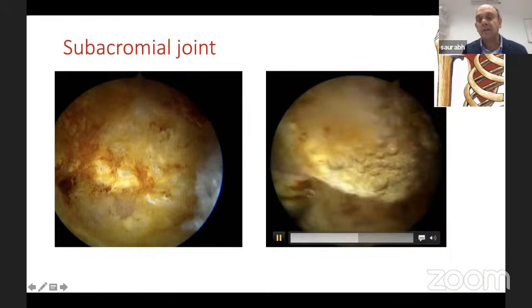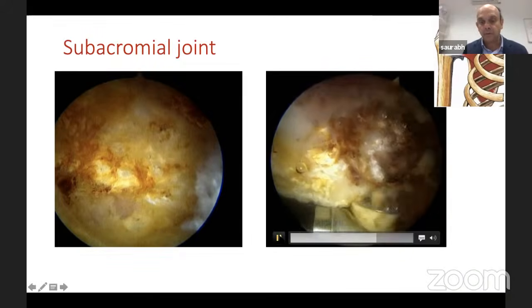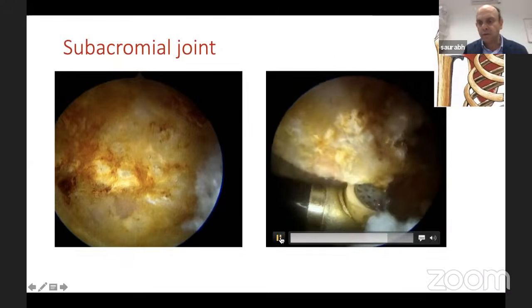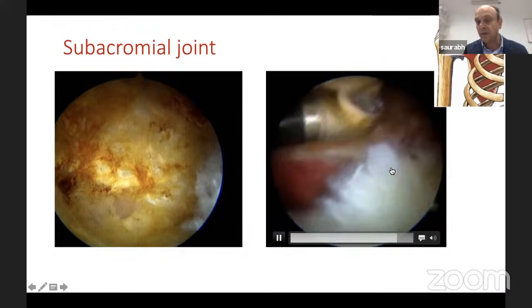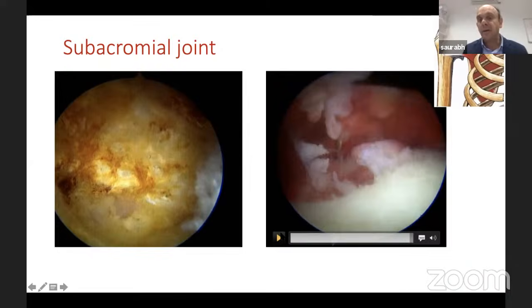So this is me with the diathermy, taking off all the periosteum. I just wanted to show you the deltoid. If you see all these red bits, that's deltoid. You don't want to go there. Again, I have turned my light source. So you saw acromion, and now you can see the needle, and this is the cuff tear, roughly a centimeter cuff tear.